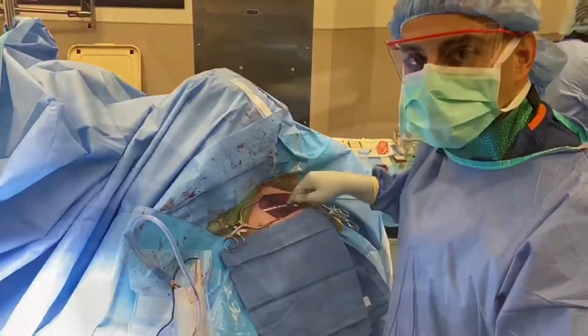Everything is nice and stable now and hopefully this clavicle is able to hold up and heal.